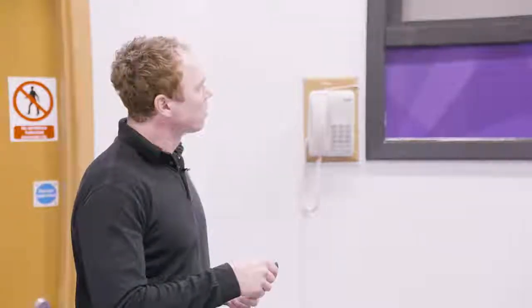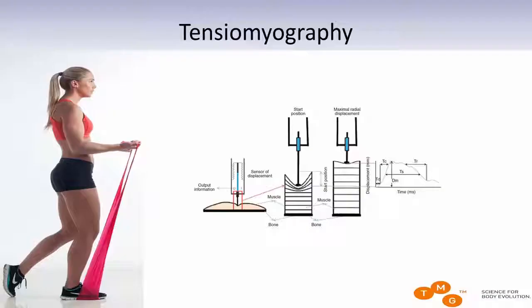Because some researchers, they also try to use some other tools to monitor what's going on with the muscle during the contraction, but the results were not as stable and repeatable. So it was found out that this is a crucial factor. You have to have the constant contact with the muscle belly, with the muscle fibers of the muscle that you're actually measuring. So when the muscle contracts, it will push the sensor tip in, and again when the muscle relaxes, it will come back to this.